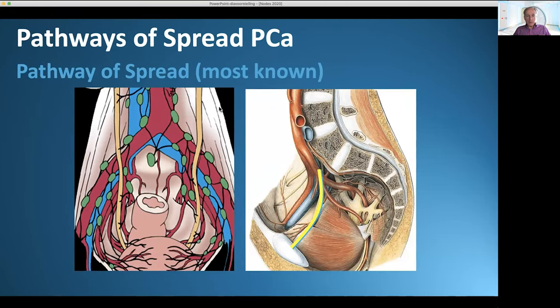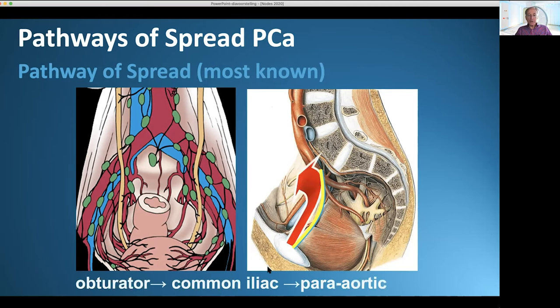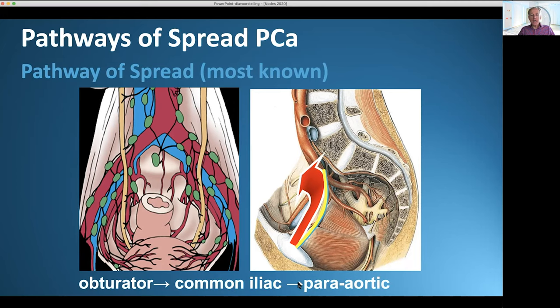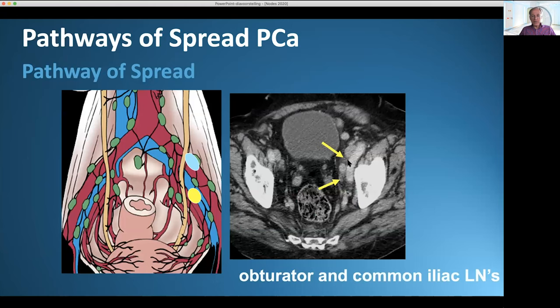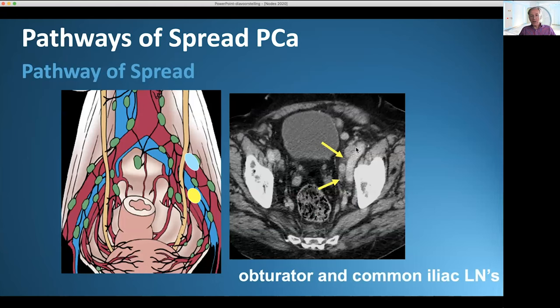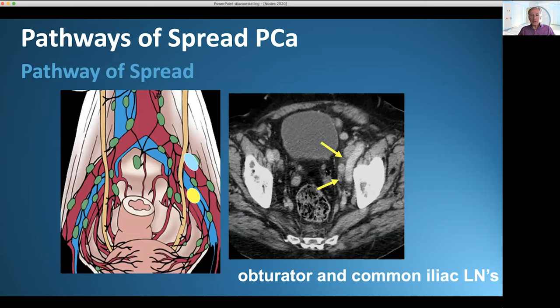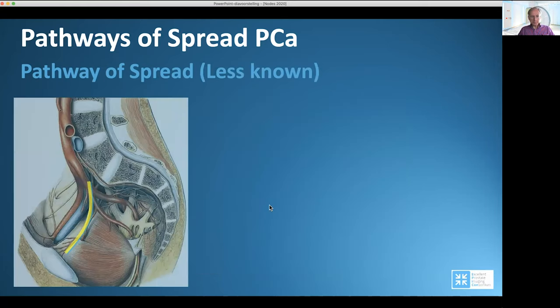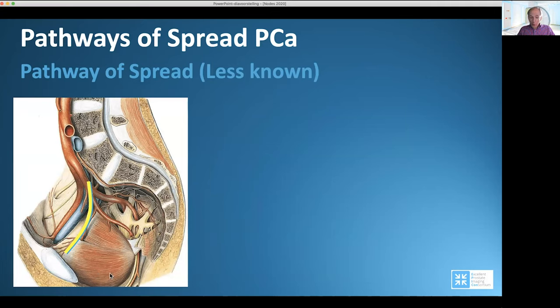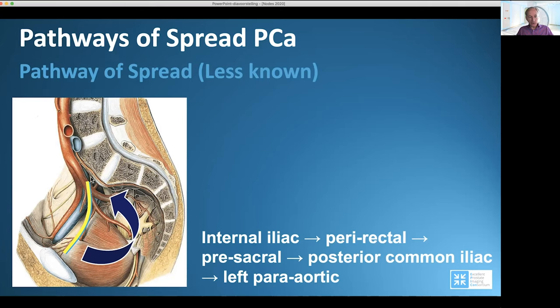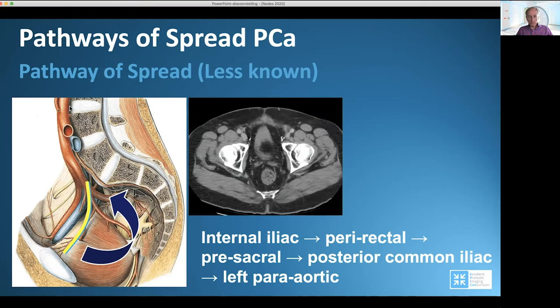The pathways of spread: the most common pathway is anterior to the obturator nerve. Metastases go from the obturator fossa to the common iliac plane, and from there to the para-aortic plane. The lymph nodes along the external iliac vessels and slightly dorsal to them are in the obturator and external iliac plane — the first station of metastasis in prostate cancer. A less known but important pathway is the dorsal route: from the internal iliac to the peri-rectal and pre-sacral, and from there behind the common iliac vessels to the left para-aortic region.